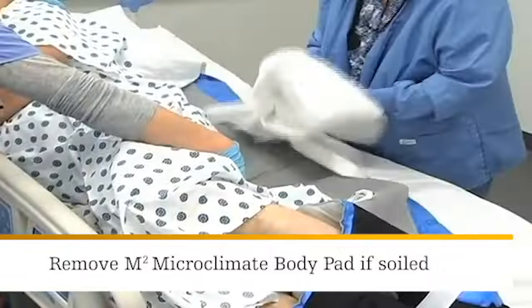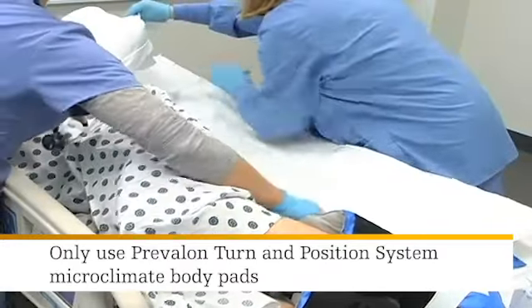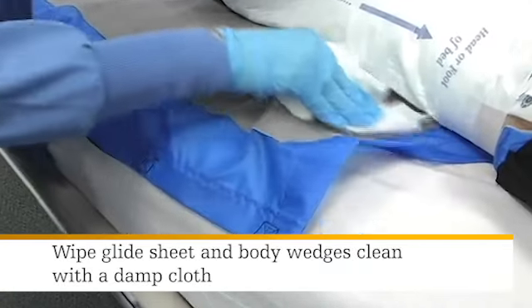If the microclimate body pad is soiled, simply remove it from the glide sheet and replace it with another. Only use the Turn and Position System microclimate body pads. If the glide sheet or body wedges become soiled, simply wipe clean with a damp cloth.